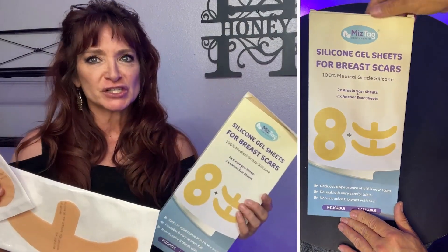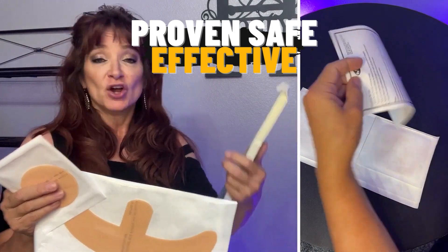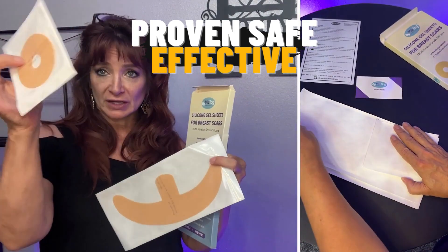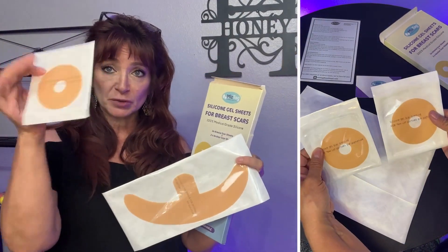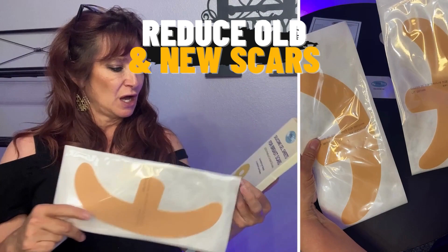These are silicone scar sheets specifically for any kind of breast augmentation you might have had, or any kind of scars that you might have in that area. It comes with two of these and two of these — this is the four pack. These are the Anchor ones and these are the Areola scars.